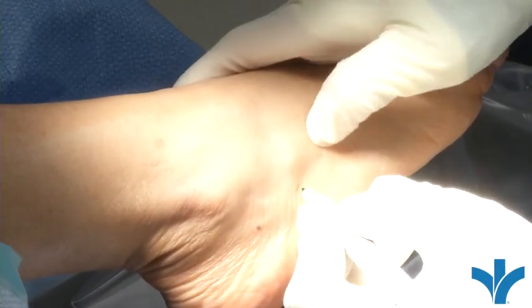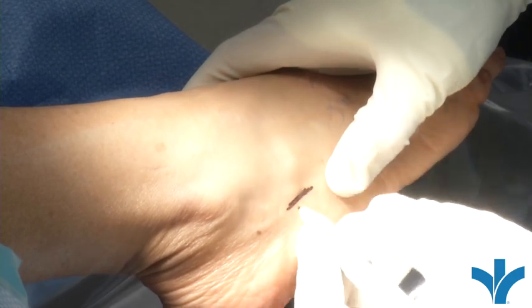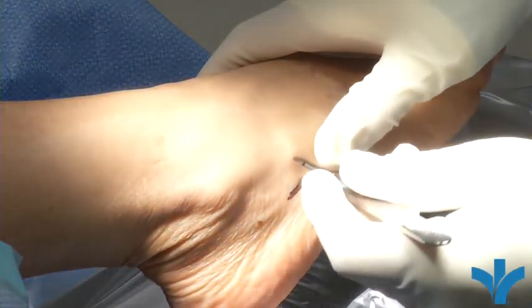The great thing about this surgery is it's essentially percutaneous — usually what I call two-stitch surgery. We're really able to do it through very, very small incisions and aid the patient's recovery process because of the neat tools we have now in order to do this.